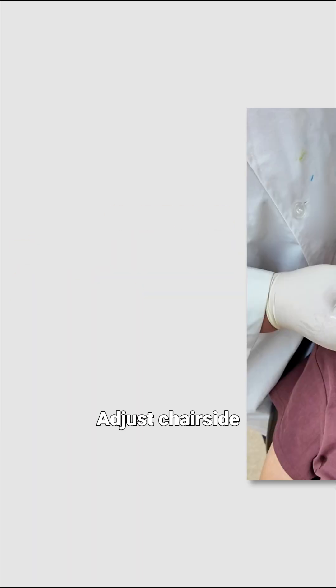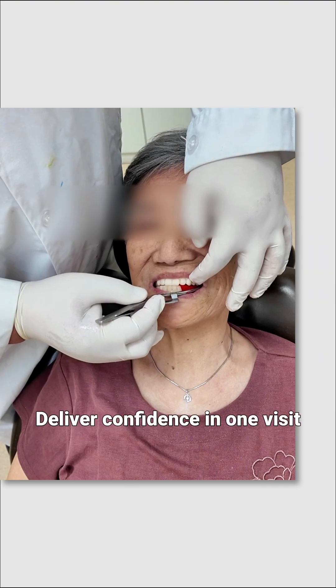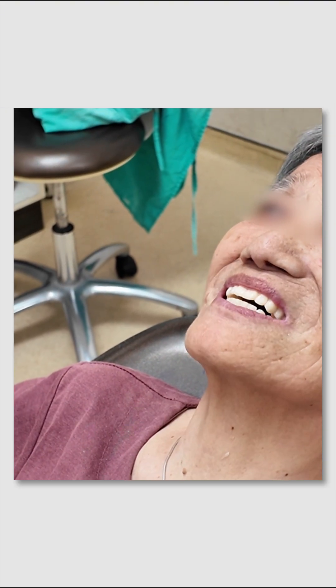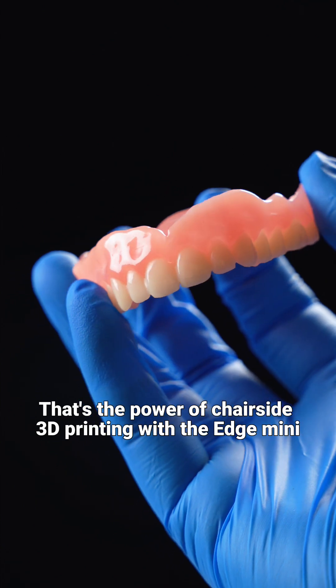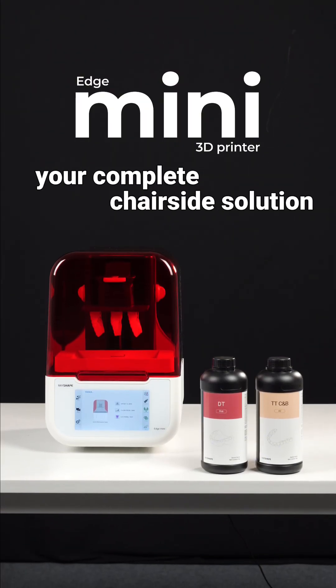Step 4: Try and Same Day. Adjust chair-side. Deliver confidence in one visit. From scan to smile — that's the power of chair-side 3D printing with the Edge Mini, your complete chair-side solution.